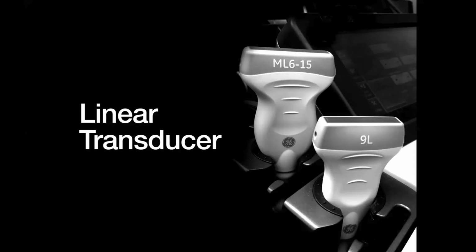And so we don't have to worry about penetrating through layers and layers of skin and muscle and soft tissue and various things like that. And so we don't need depth, right? The depth of the normal eye isn't that deep. And so we can sacrifice that penetration to gain resolution when we use the high frequency transducer. So grab the linear, right?